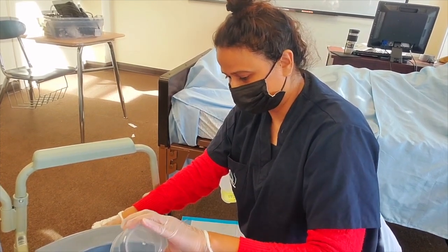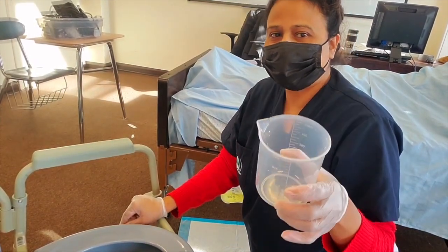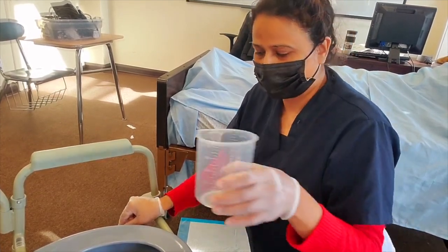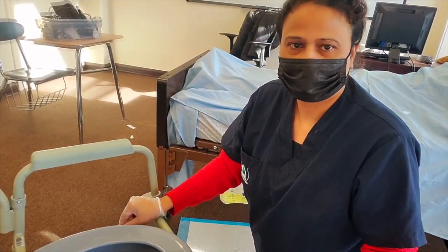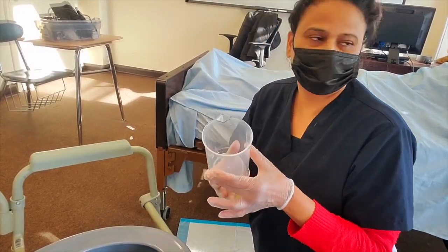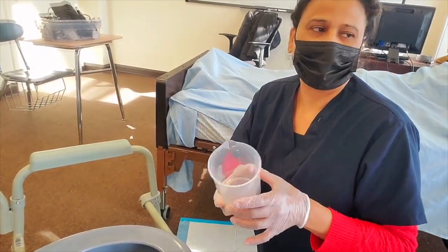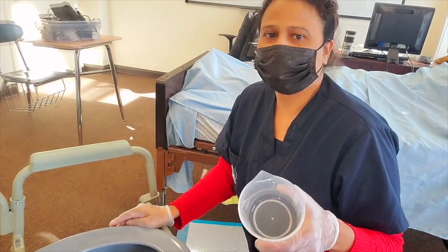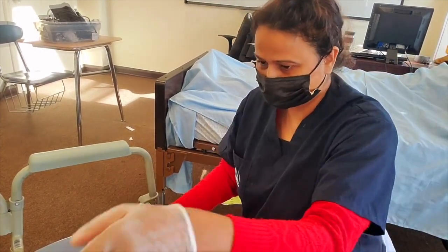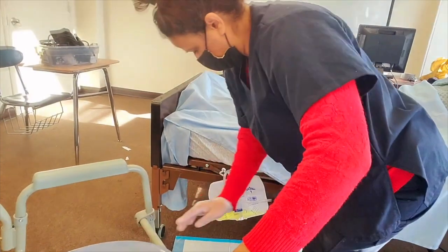Then dump it, and you have to disinfect the graduated cylinder three times. Dump, disinfect, dump. Take a dry paper towel, wipe the graduated cylinder, and place it back at its designated area.